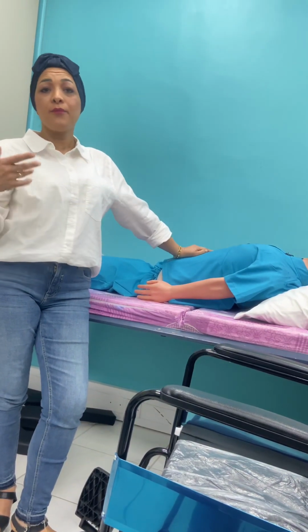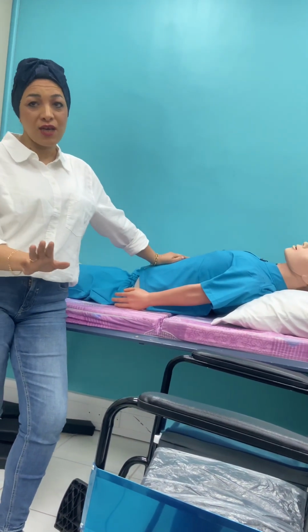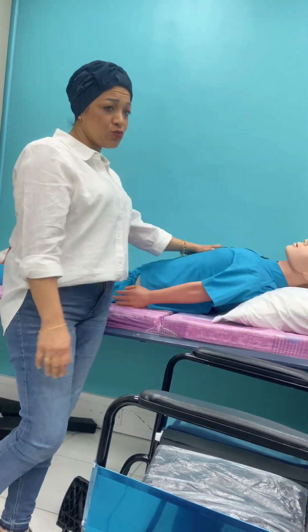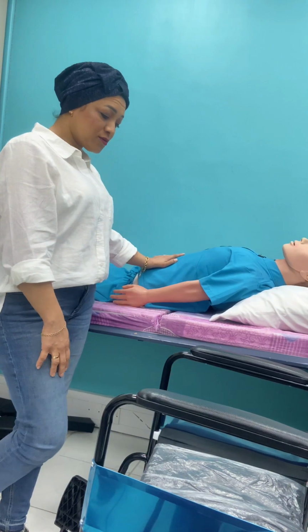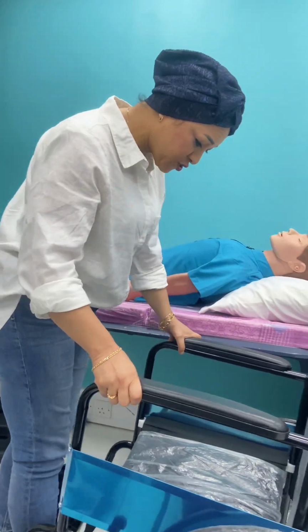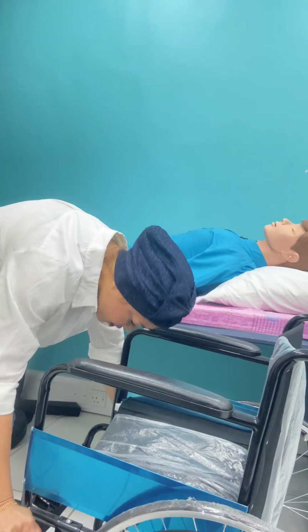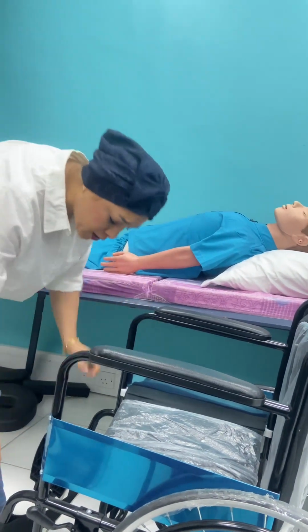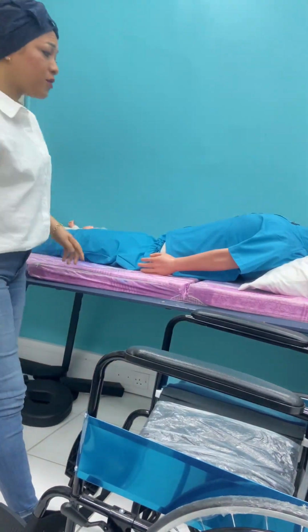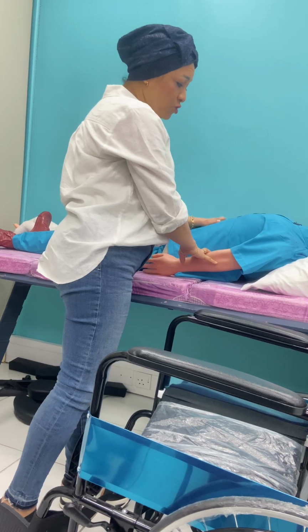You can go for ROM, of course, before doing this. Otherwise, it's just to save time now. You know the situation of the patient, so you know which leg is stronger. So, I put the chair next to the bed. Very, very important is to lock. I have to lock the chair so that it doesn't move, and open the footrest. For the safety of the patient, of course.